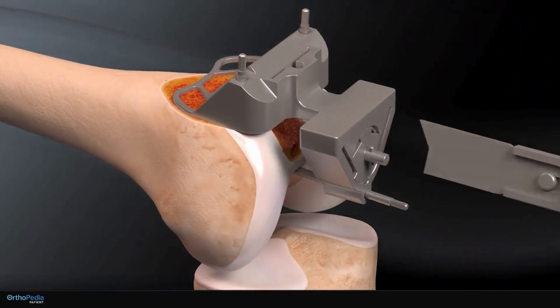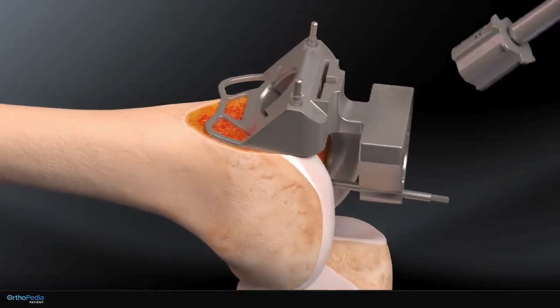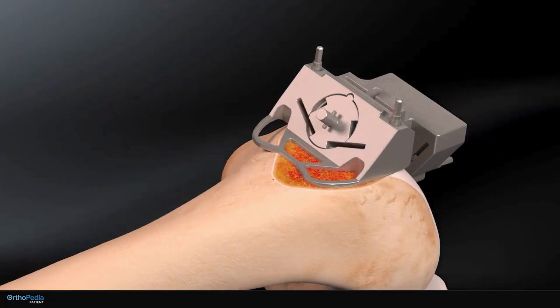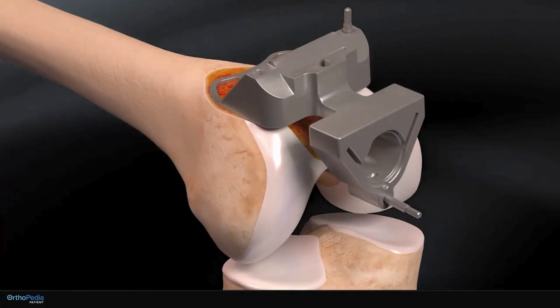A chisel-like instrument called an osteotome is then inserted into the slits of the guide to help remove the remaining bone. The pins and guide are then removed.